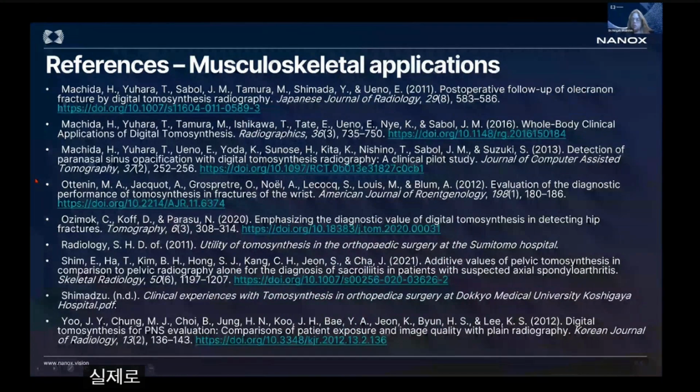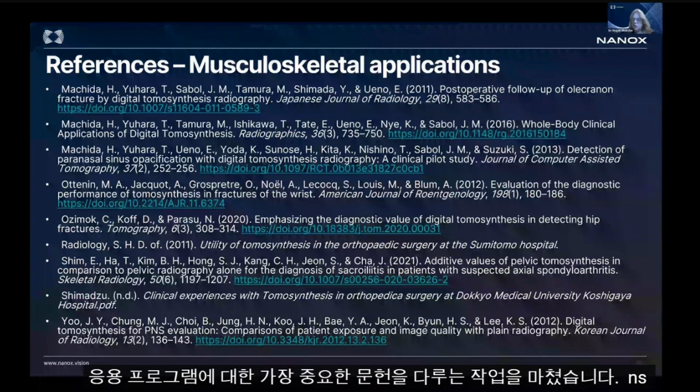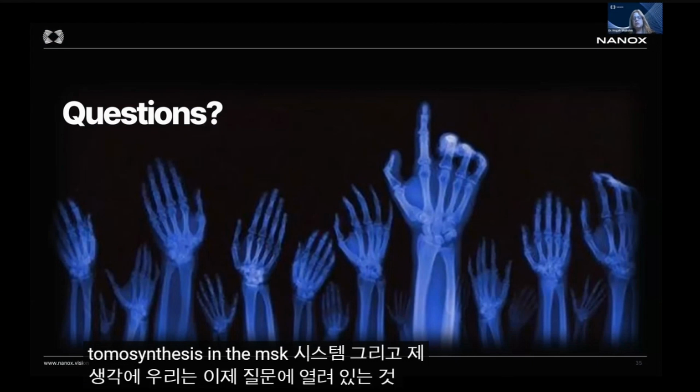And I've finished showing you those examples and covering the most important literature about the applications of tomosynthesis in the MSK system. And I think we're open for questions now.